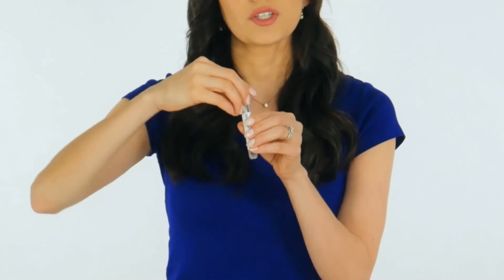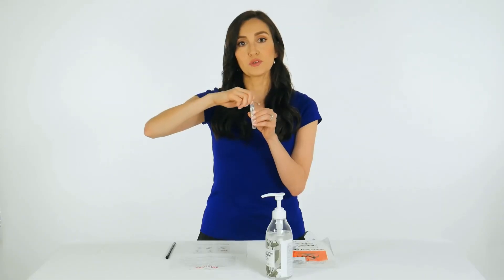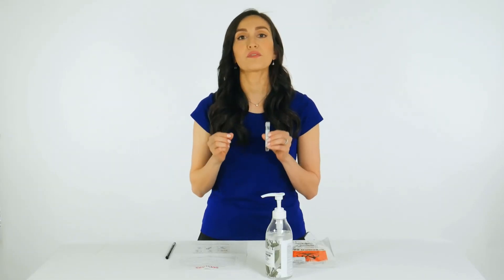Tightly screw the cap onto the tube. Return the tube as instructed by your health care provider.